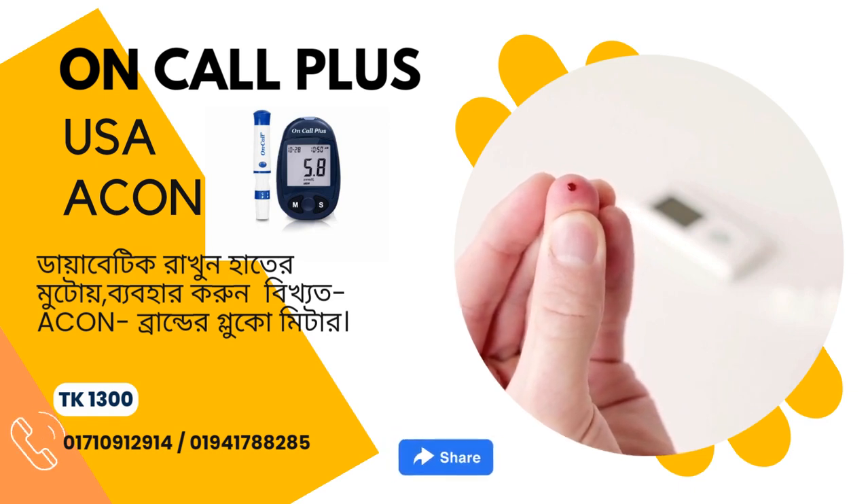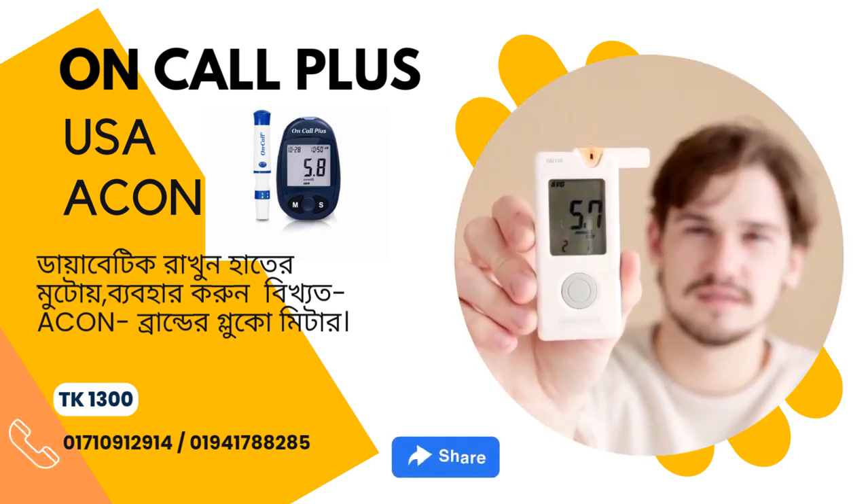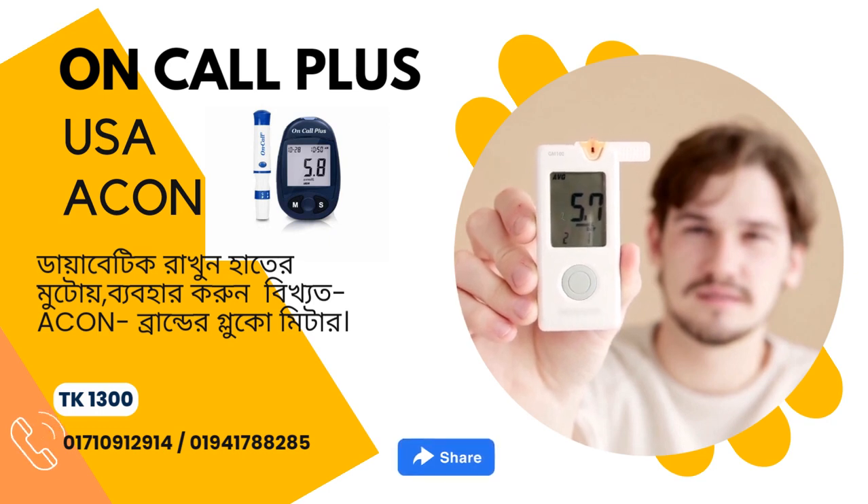On-Call Plus Blood Glucose Monitoring System: reliable and convenient. Accurate results in 10 seconds. Affordable — frequent testing helps improve control. Less pain with a very small blood sample. Fingertip or forearm testing. For use with On-Call Plus blood glucose test strips.